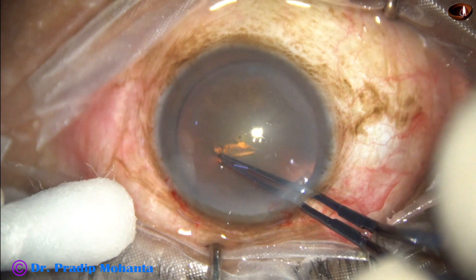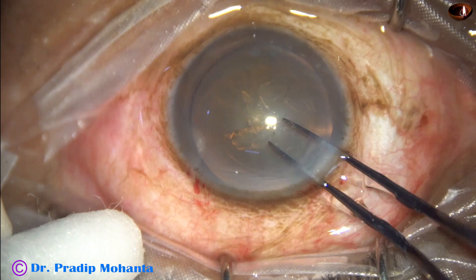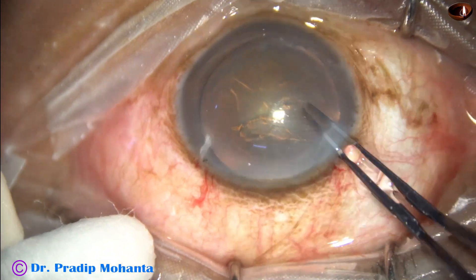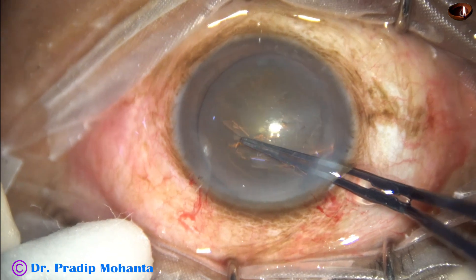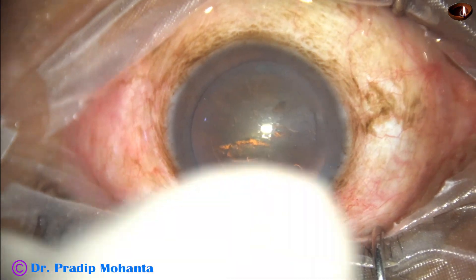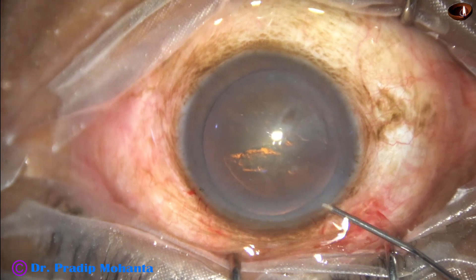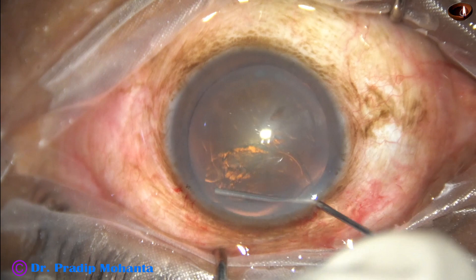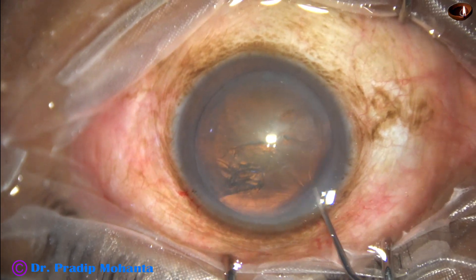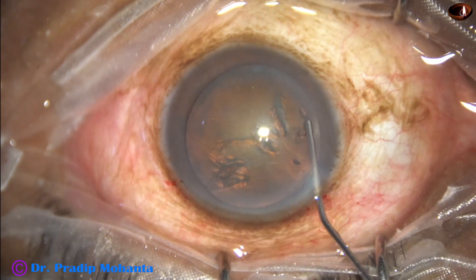By this time, incisions have been made and now capsulorhexis is being done with the help of Utrata forceps. An adequate size rhexis of about 5.25 millimeters has been done, and now hydrodissection is being done with a 27-gauge cannula and BSS. The nucleus is tapped and mobilized.